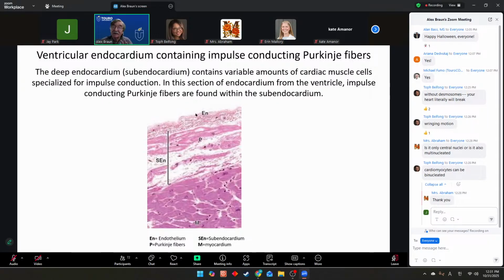Although it is hard to see the endothelium in this image, realize again that by handling and by changes that occur after a tissue is removed from the body or the person dies, the endothelial cells can fall off. So that's an artifact. During life, there would be flattened endothelial cells, and sometimes you see them well in a specimen, and sometimes you don't. In this particular specimen they are a little bit challenging to see, but it doesn't worry me too much. I know there must be endothelial cells during life. Underneath that is the subendothelial connective tissue.